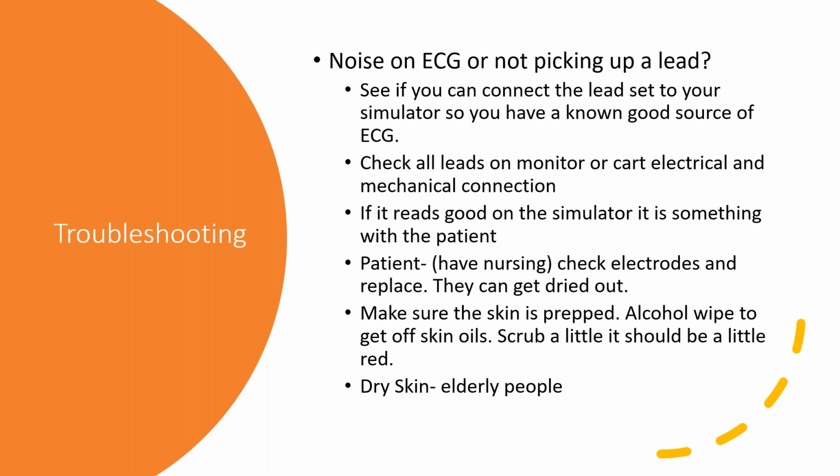What I do is the stretch test on those. I pull on them a little bit. If they feel like a rubber band, usually they have a bad connection. You can take your meter and test continuity across it to see if you have a bad connection there, but first I start with the stretch test. If it stretches at all, throw it in the trash.